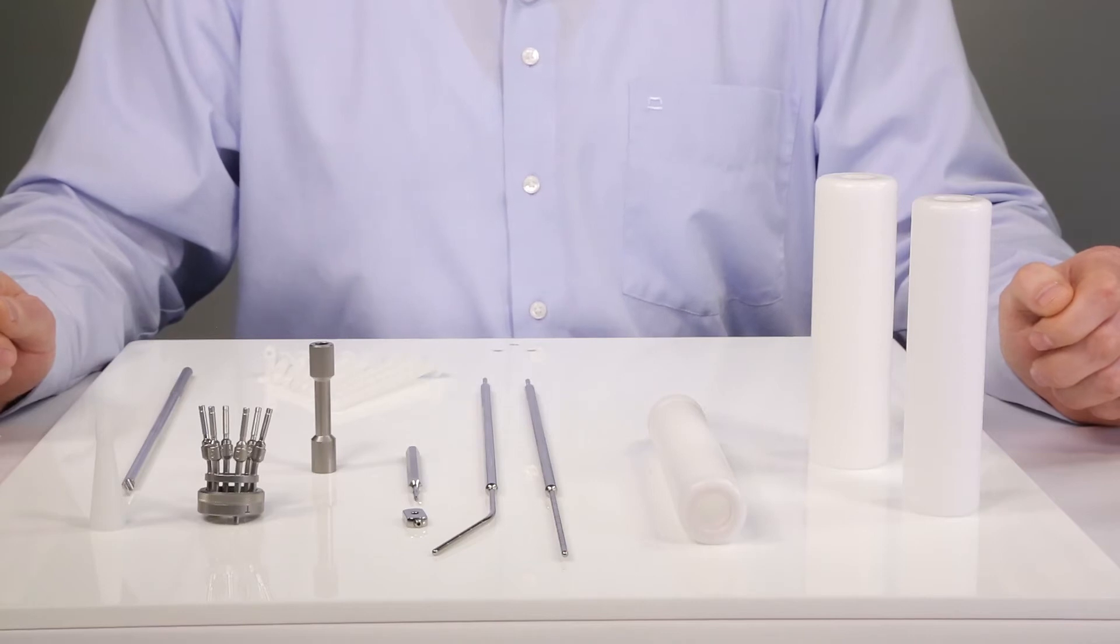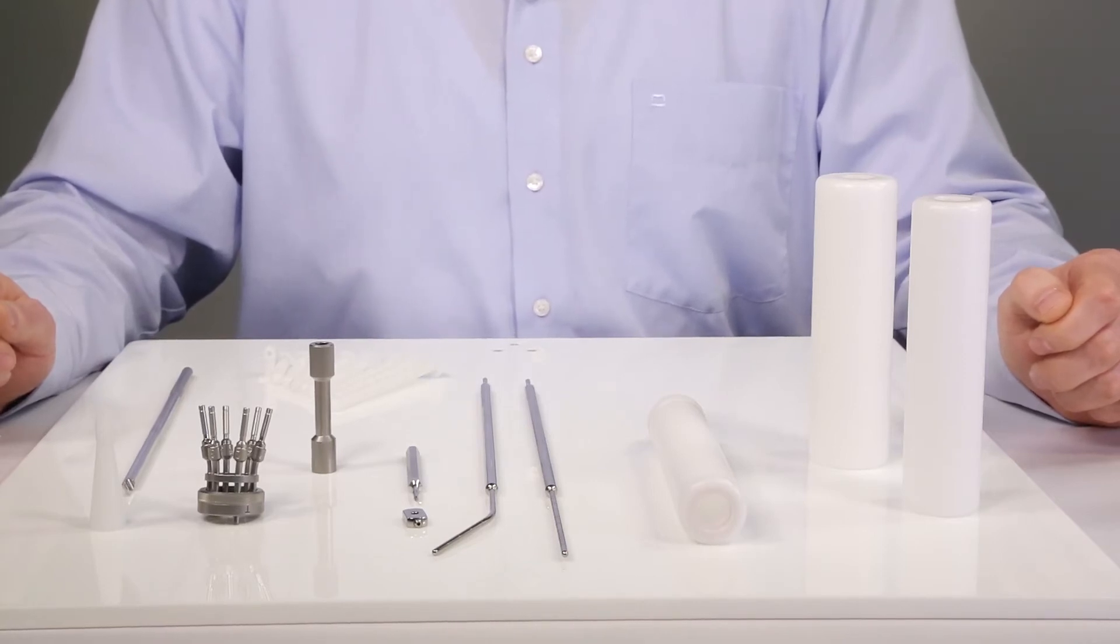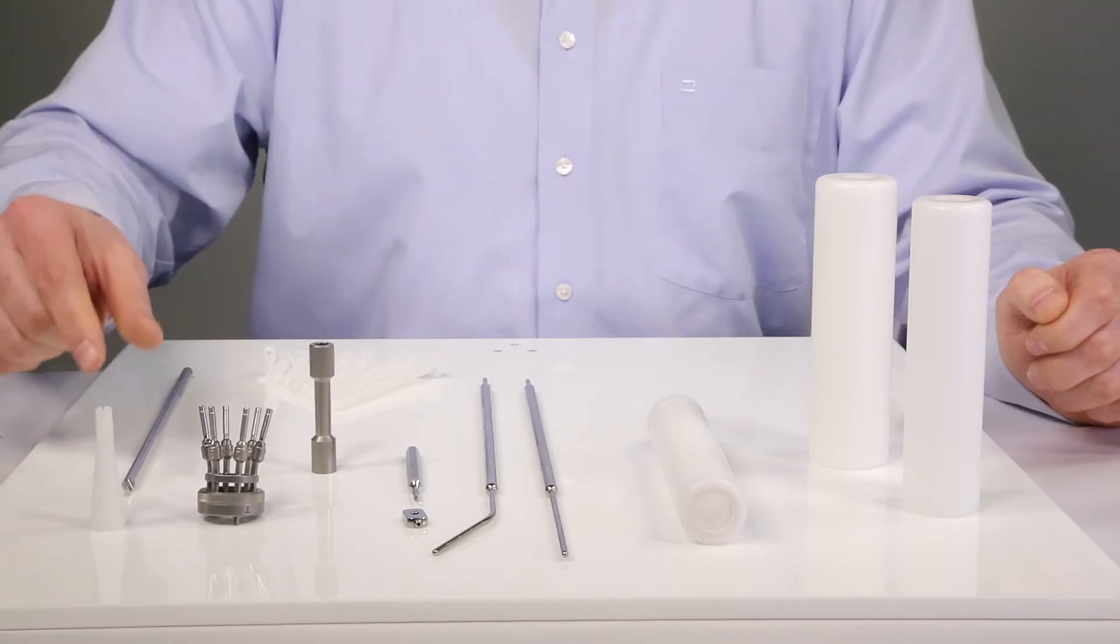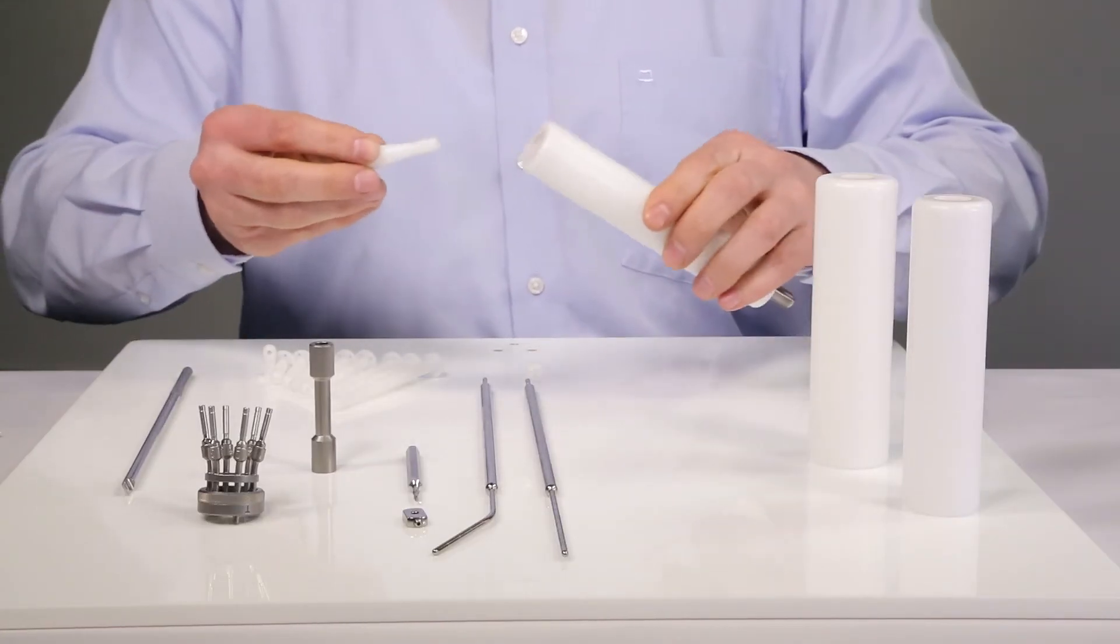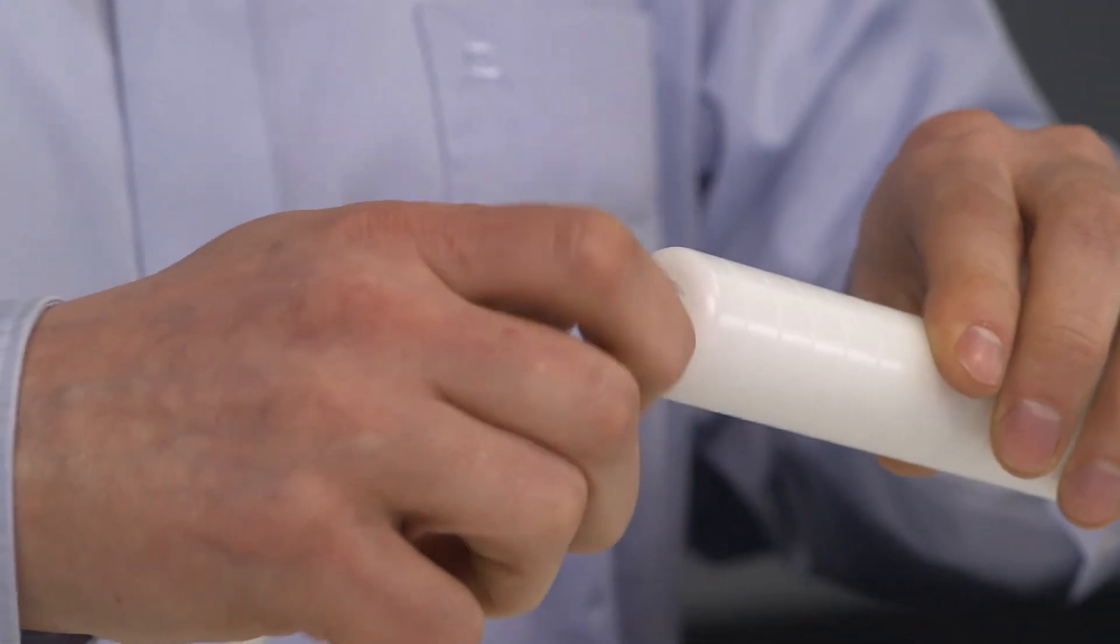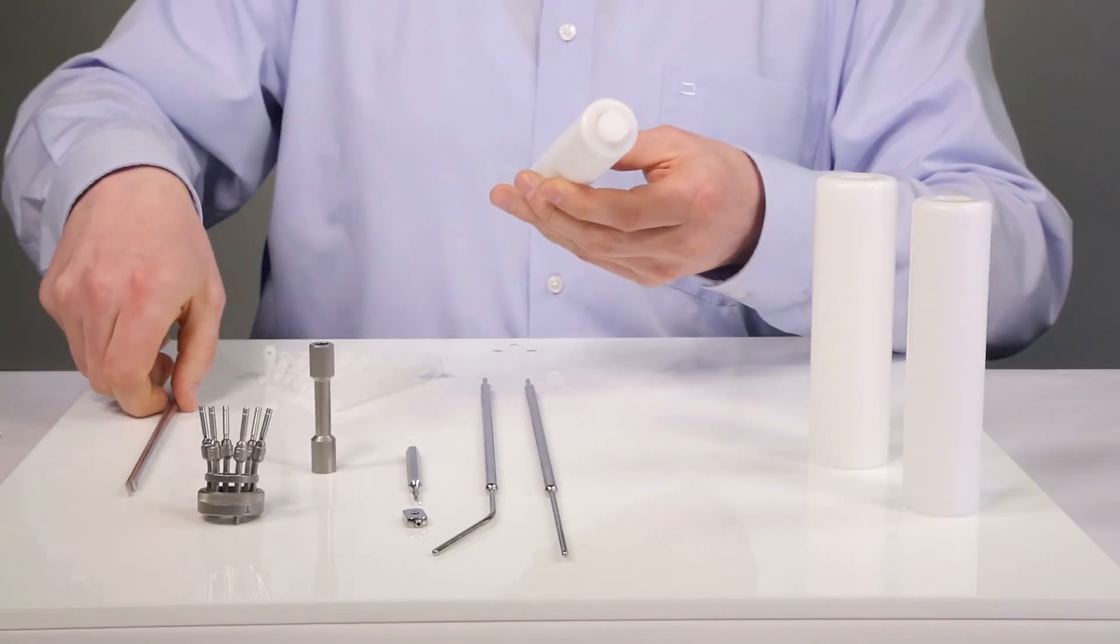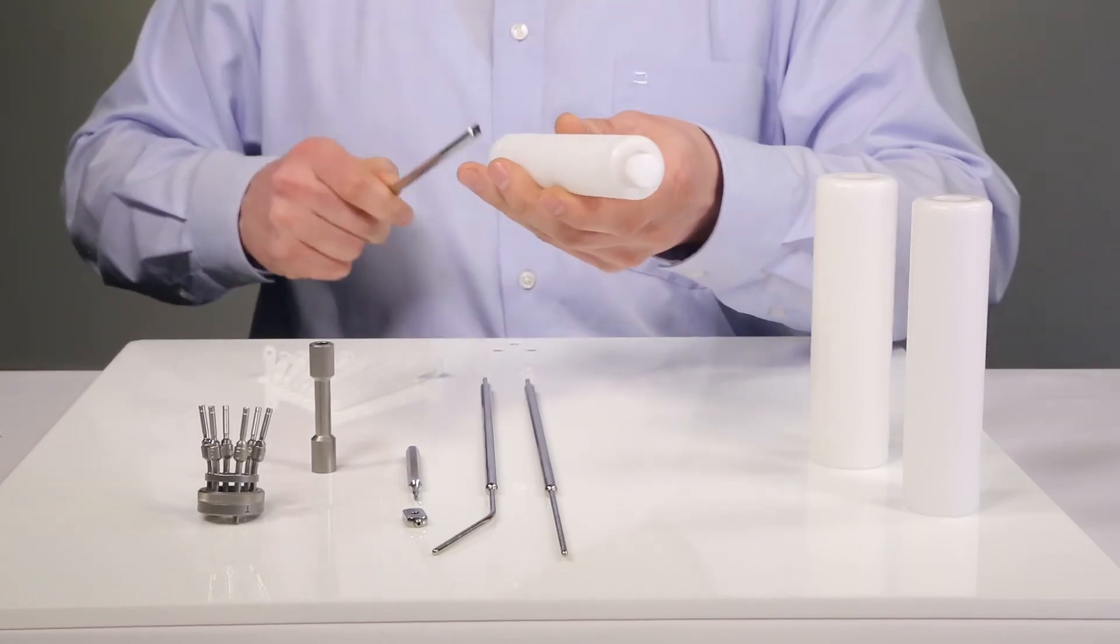An alternative configuration of the Miami applicator does not use the intrauterine part. The stump plug can be used and inserted inside the tip of the Miami applicator and screwed in tightly with the stump plug insertion tool.